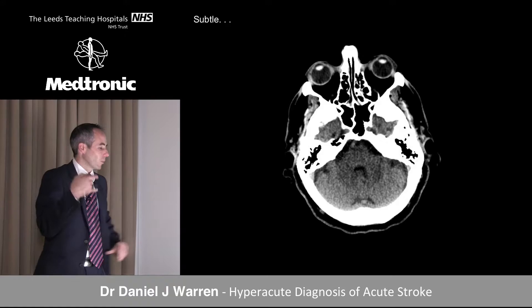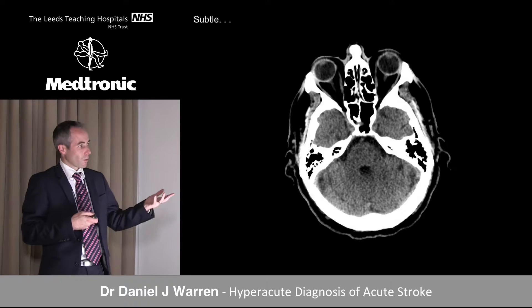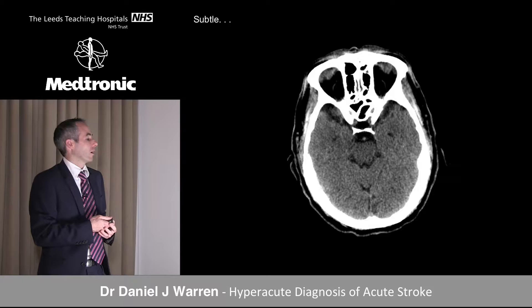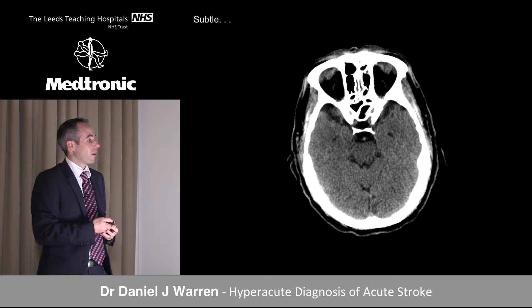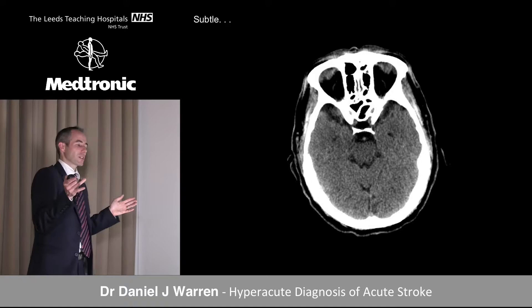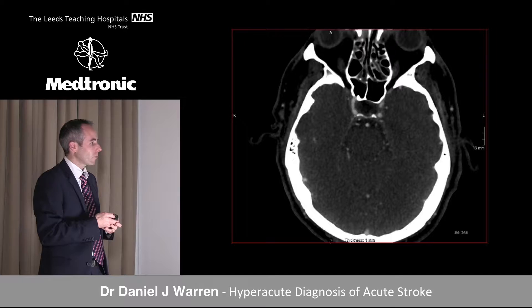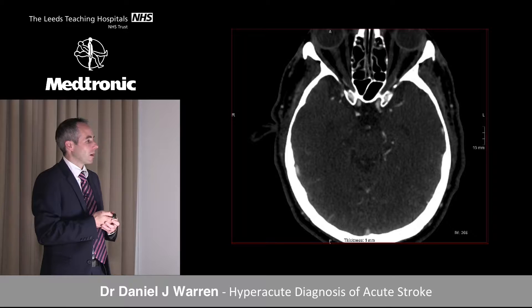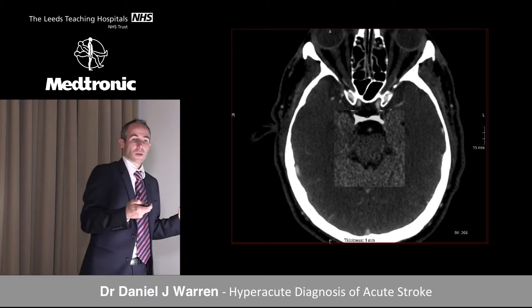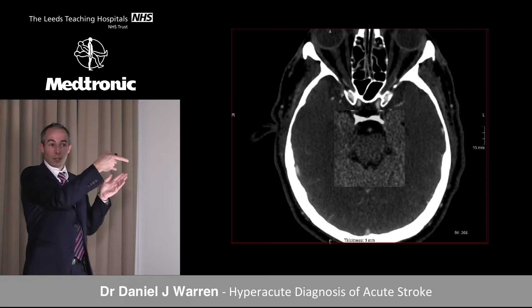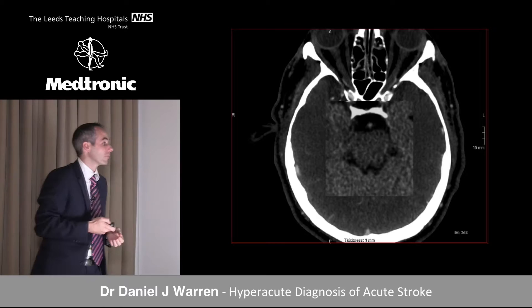Another case shows how subtle posterior circulation findings can be. With posterior circulation symptomatology and 5mm non-contrast CT slices, the basilar is identified but findings are uncertain — possibly a bit bright. There's not much to lose by doing the CT angiogram early rather than too late. The CT angiogram at mid-basilar level confirms intraluminal thrombus. It's subtle without a paired vessel — clinical suspicion is critical, and with any doubt, thin reconstructions and CT angiography are indicated.